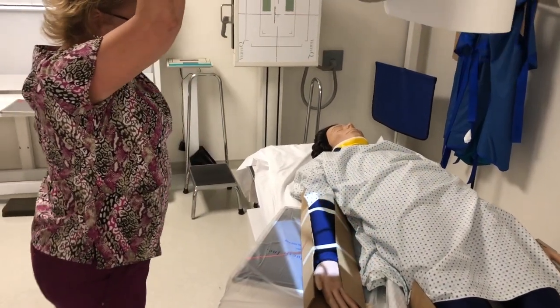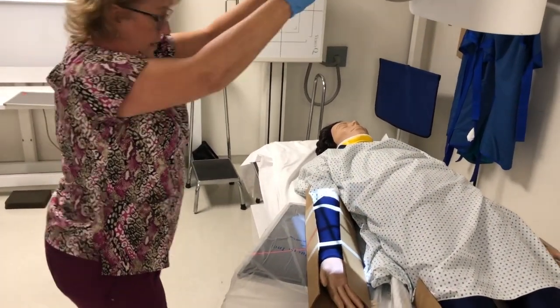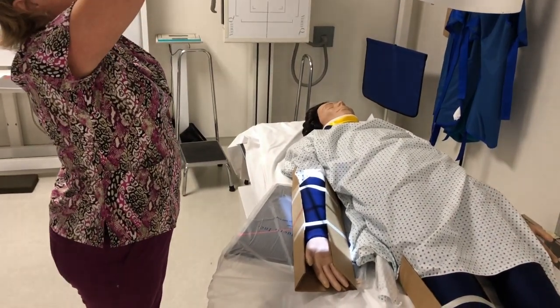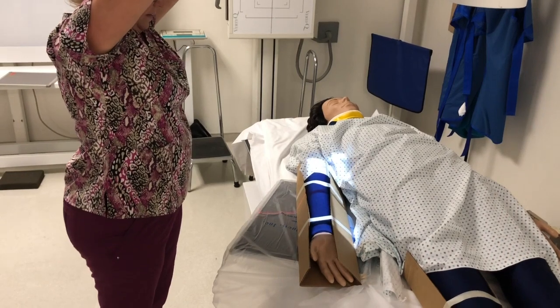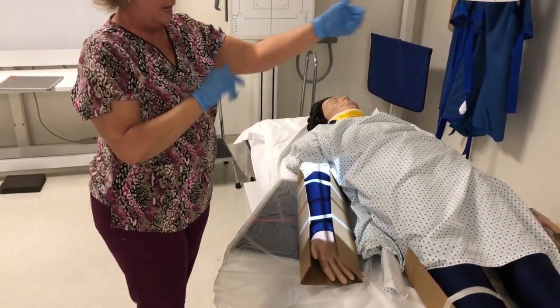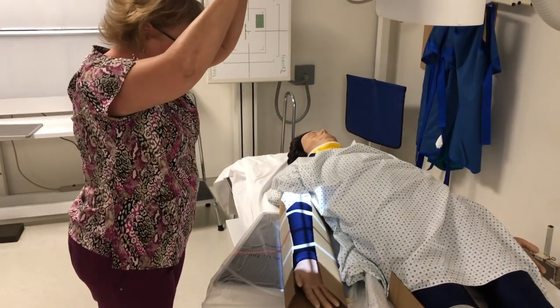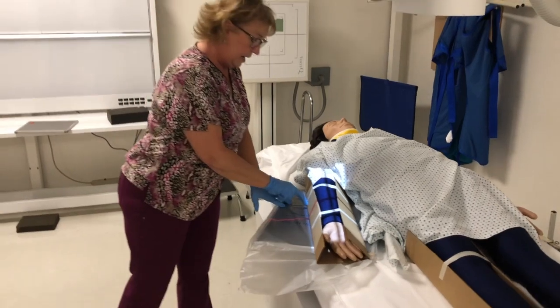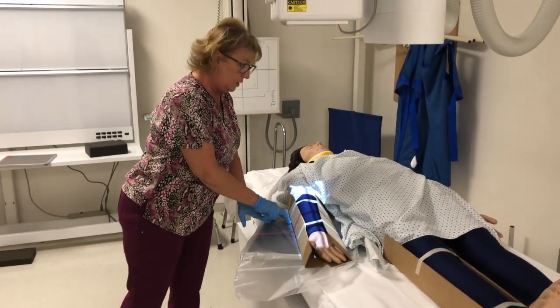Then I would set up, and again, I'm moving everything rather than having this patient move. So I would adjust it. I would place my right marker in the field of view.